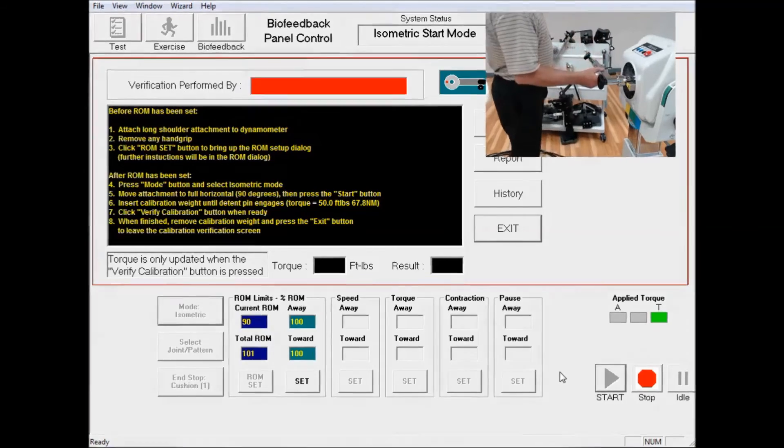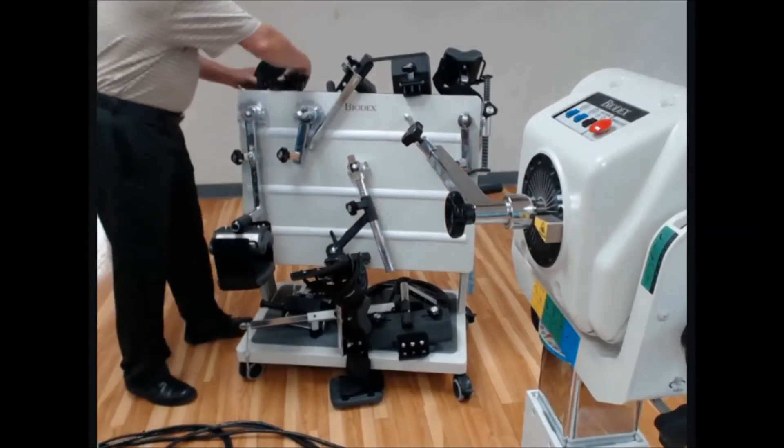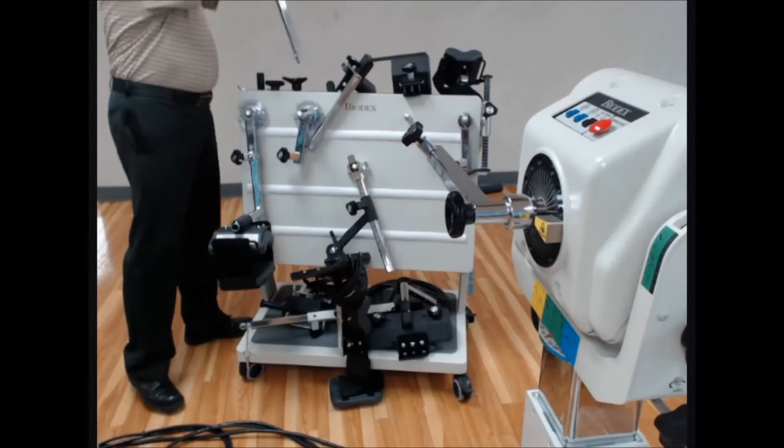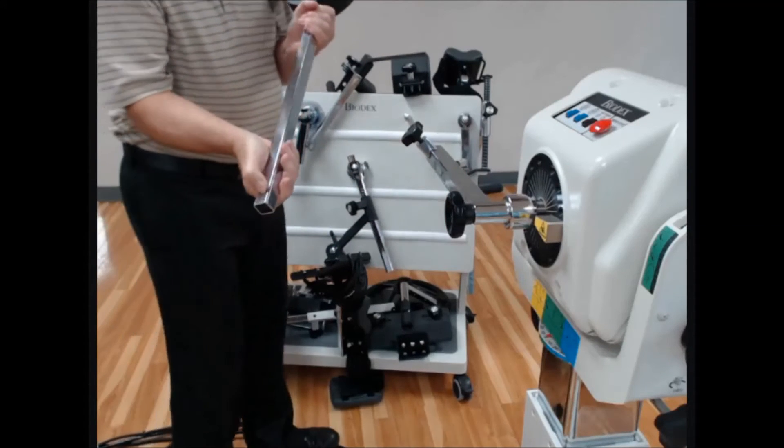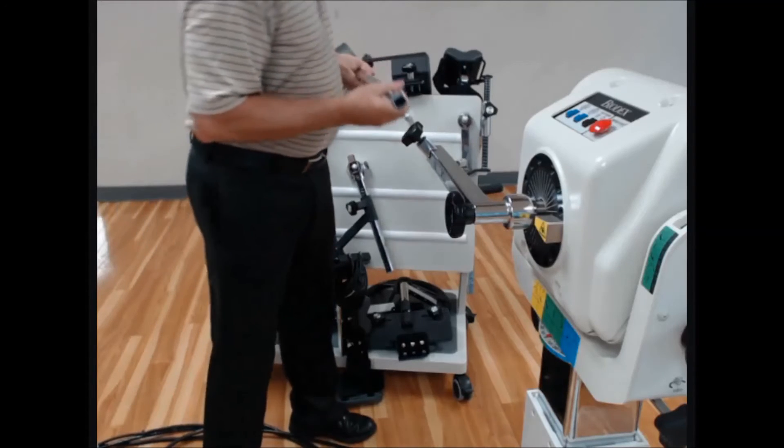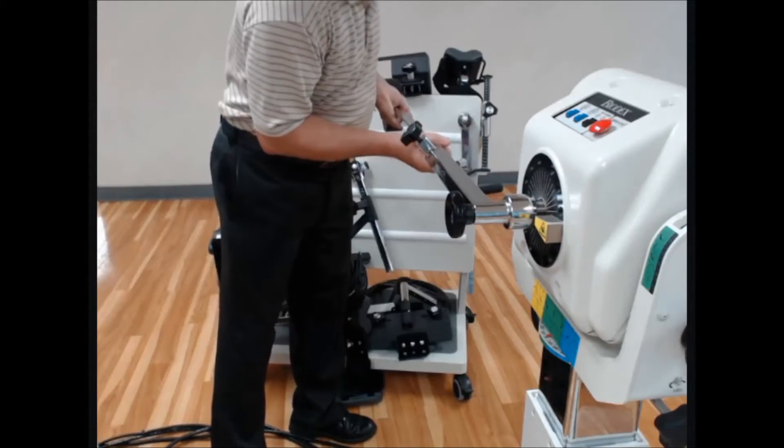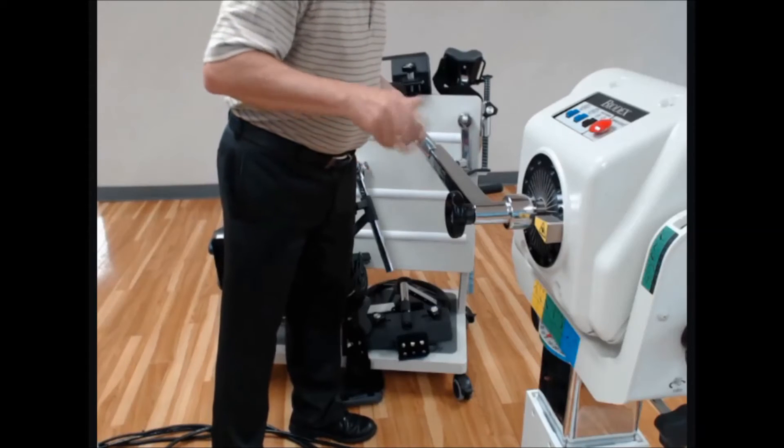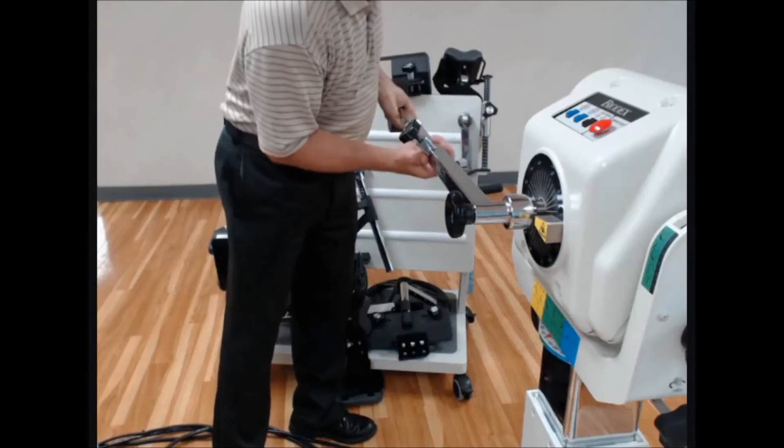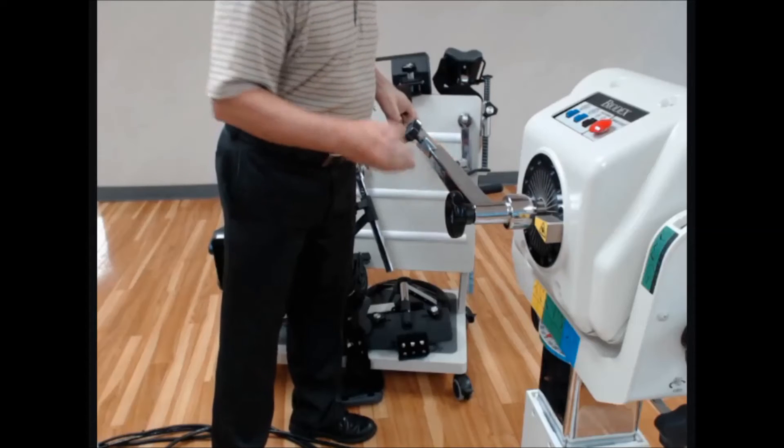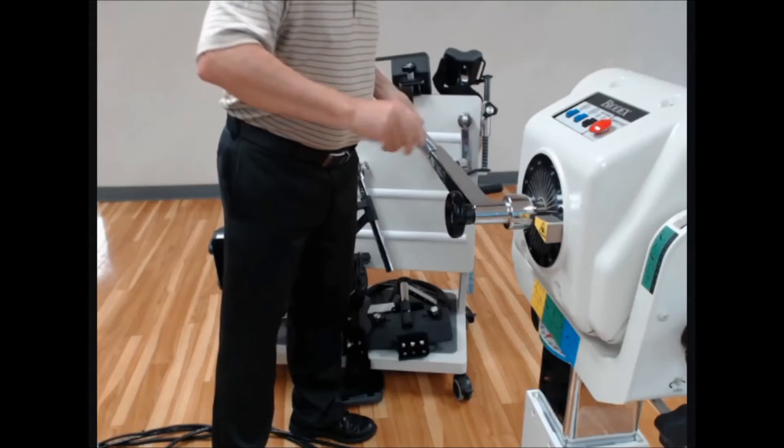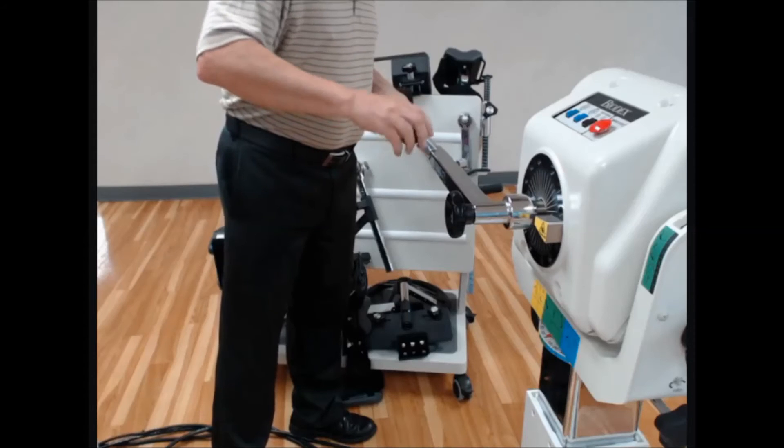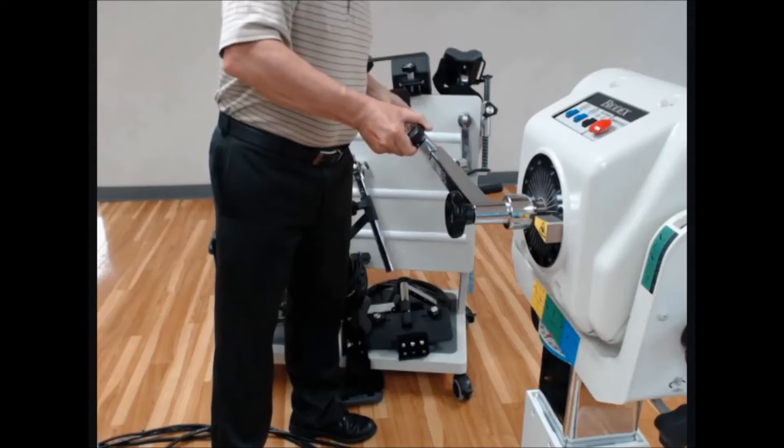At this point, we're going to take the calibration weight. There's a button and there's a hole on the attachment that we want to match up. You can hear it click into position, lock it down. And that should hold in that position.